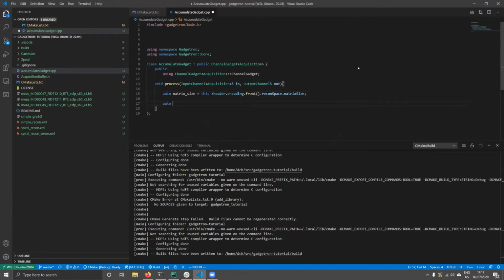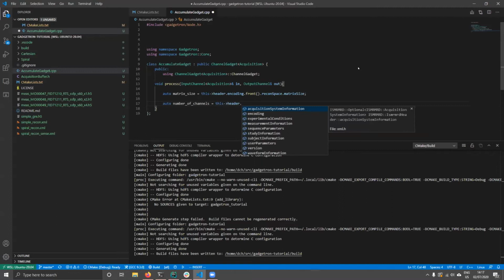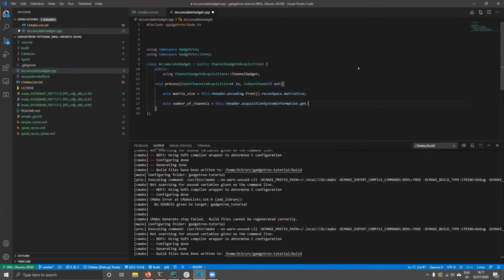But we don't only want a matrix size. We also want the number of channels. And we're going to grab that from acquisition system information, receiver channels.